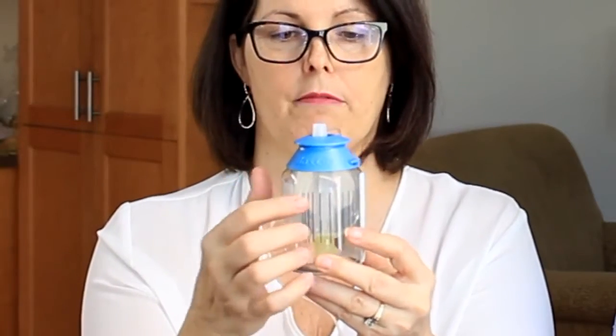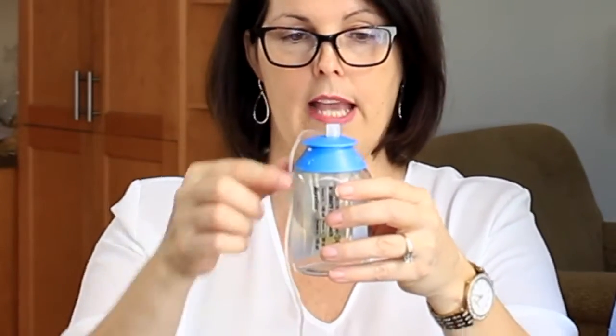And what's happening is there is a fluid regulator inside this tube that sets the rate. So on the bottle, it says, for instance, this one's going to run at a speed of 200 mils an hour. So when you take the cap off, that balloon will start to shrink. And as it's shrinking, the balloon deflates and it's pushing the fluid up through the tubing, out the end of the tubing, and into your vascular access device.